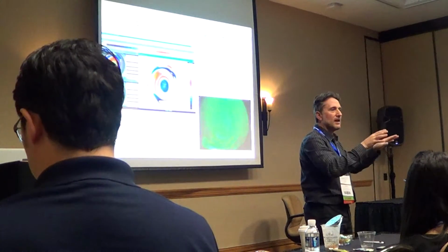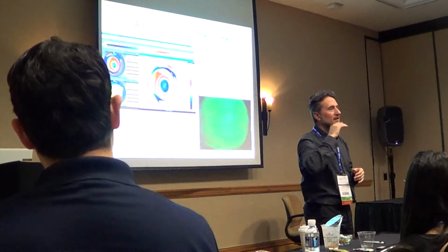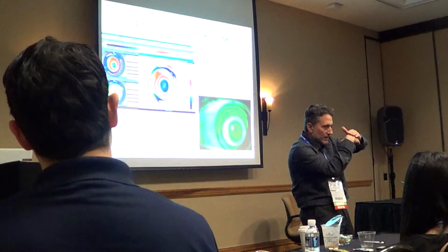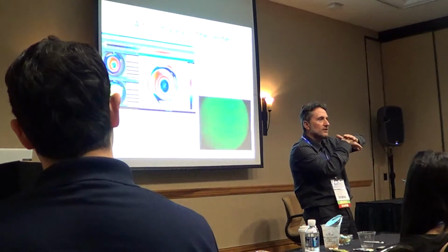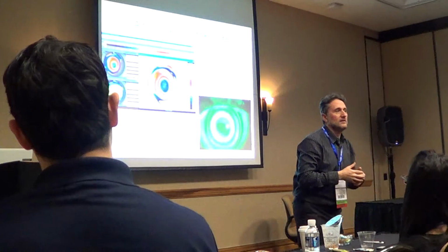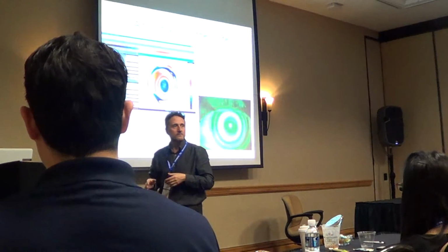You have a central island. Try to flatten the fit. The central island will not improve. It will be worse. If you steepen the fit and you create separation, not touching the apical zone, the central island will disappear. That's it. Try it. It's not me. Try it. I am 100% confident.